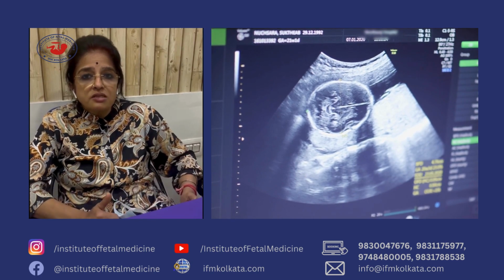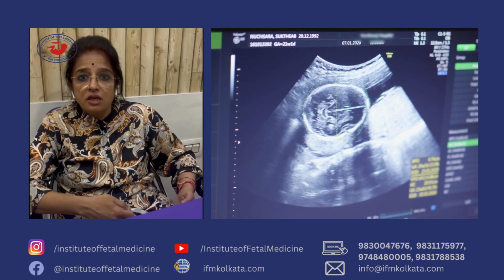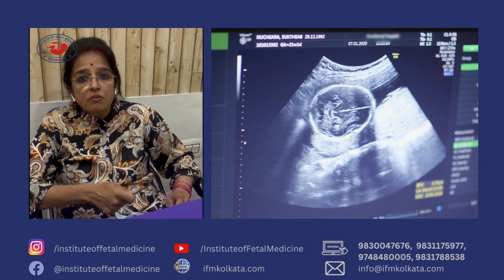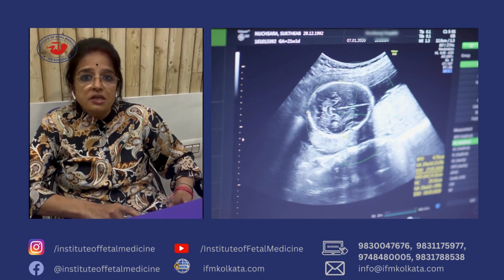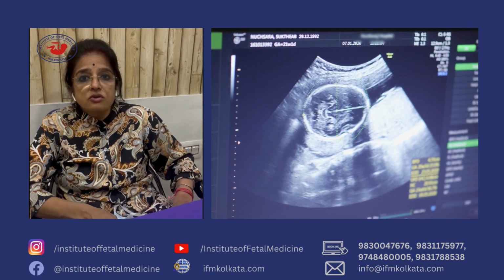There are various misconceptions regarding transvaginal sonography. The patients feel that since the probe is inserted from one patient to the other, there will be a cross infection, but that actually does not happen. We use a probe cover on the transvaginal probe before we introduce it. The second misconception is that people believe that transvaginal sonography can induce abortion if done in pregnancy. But that is also not true.